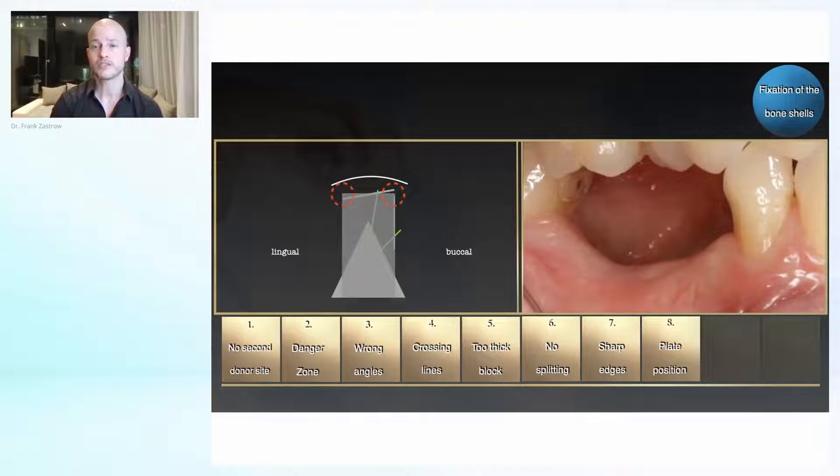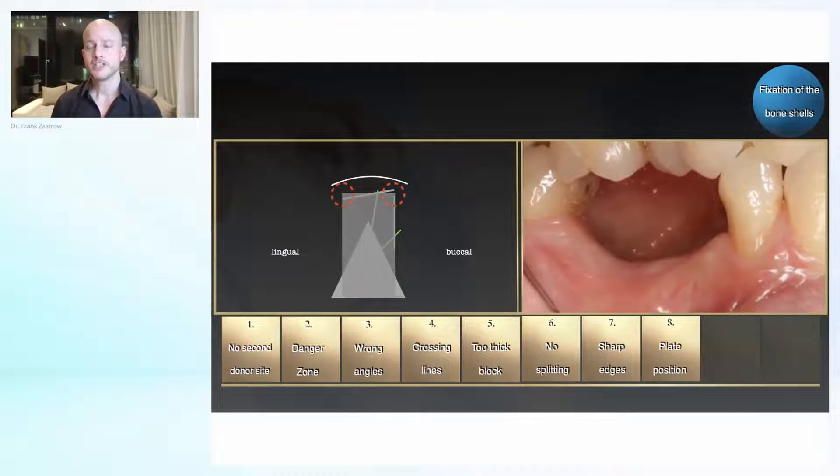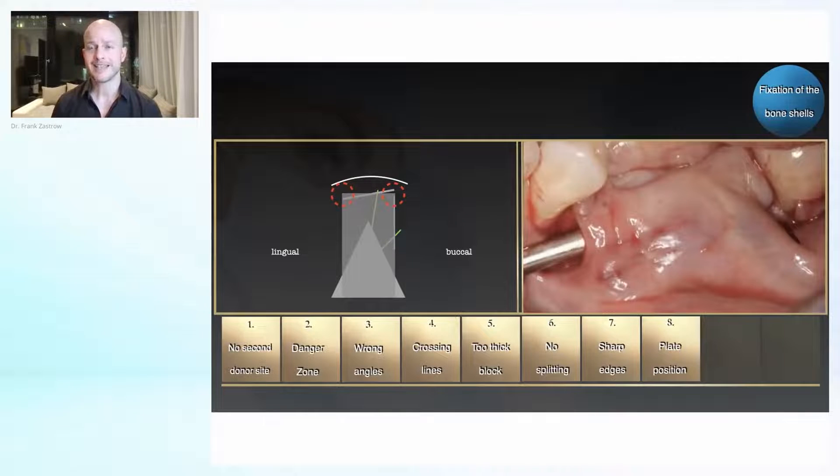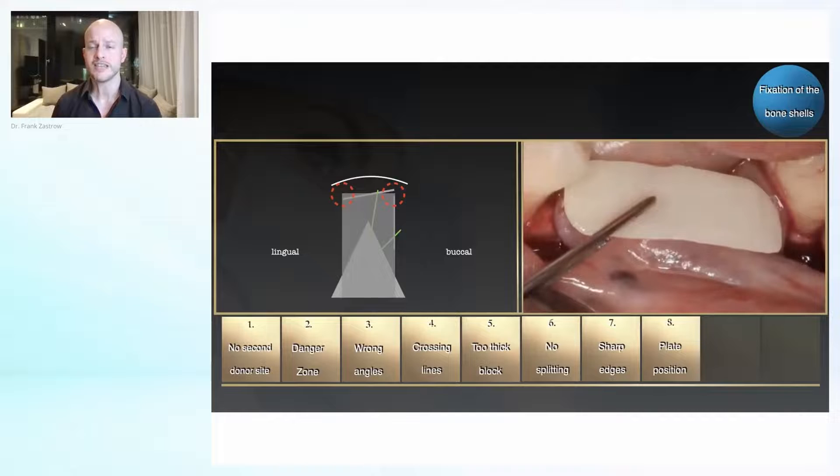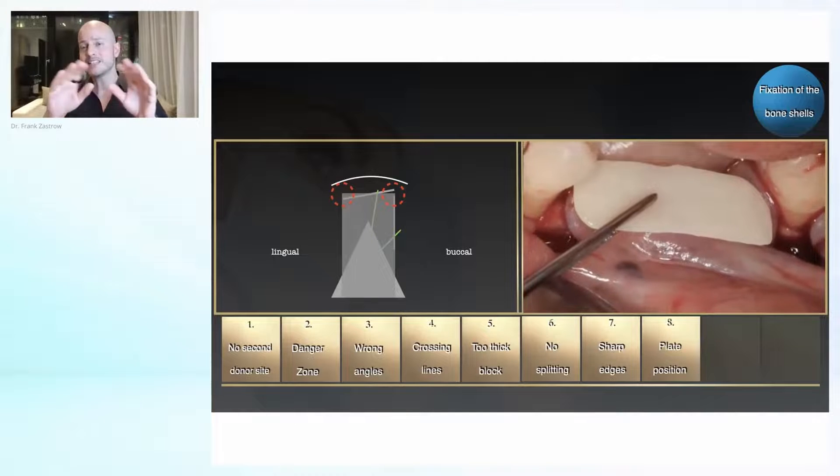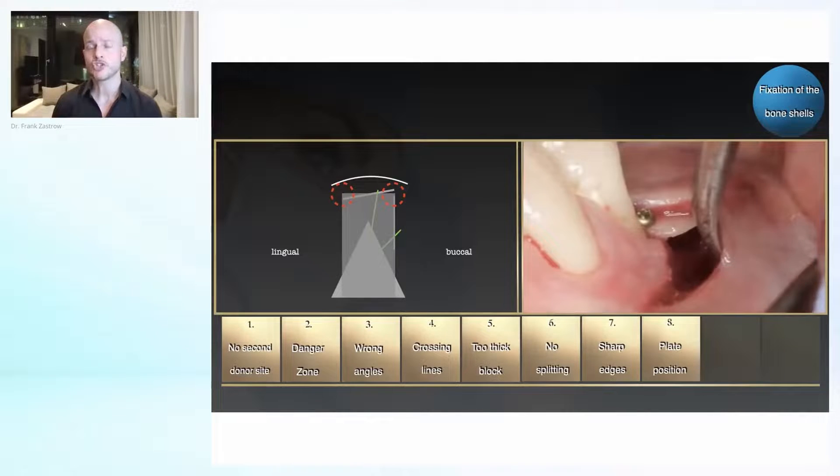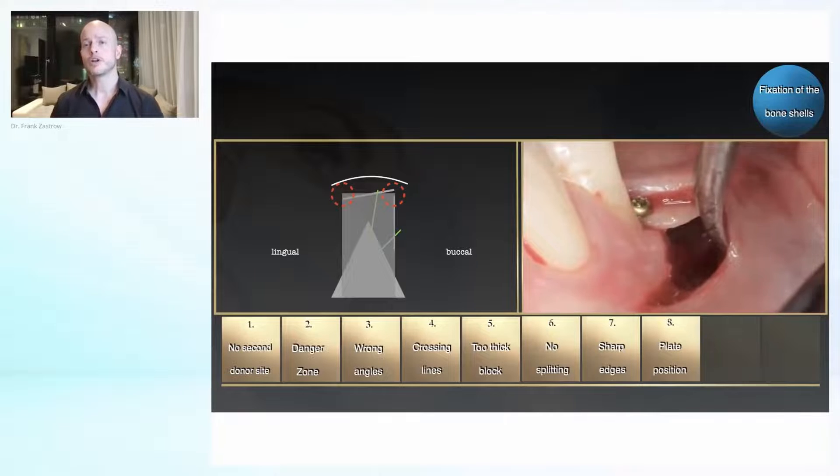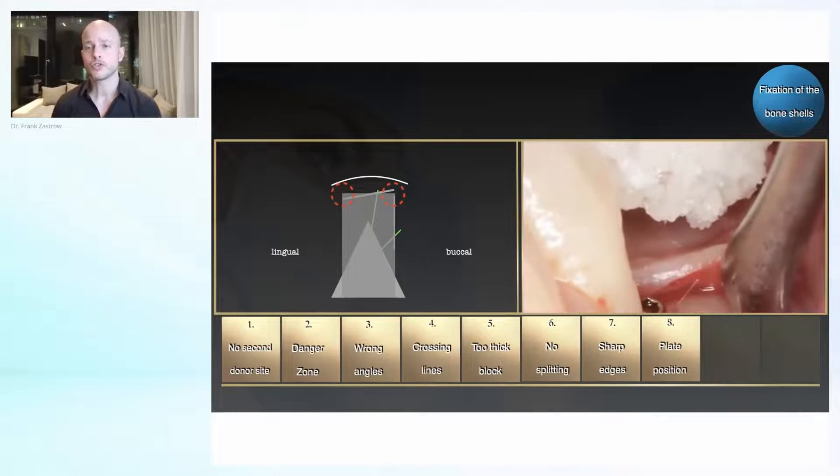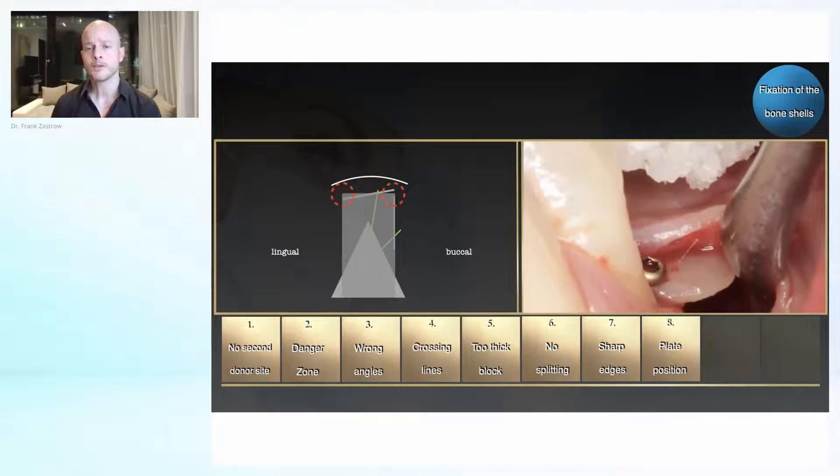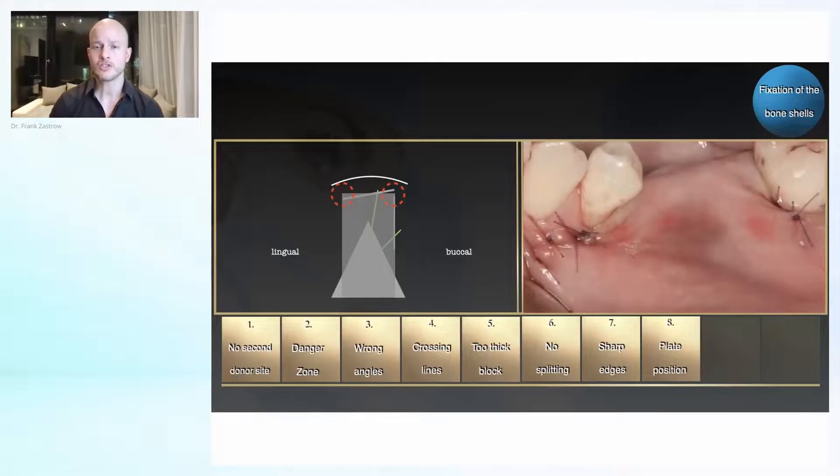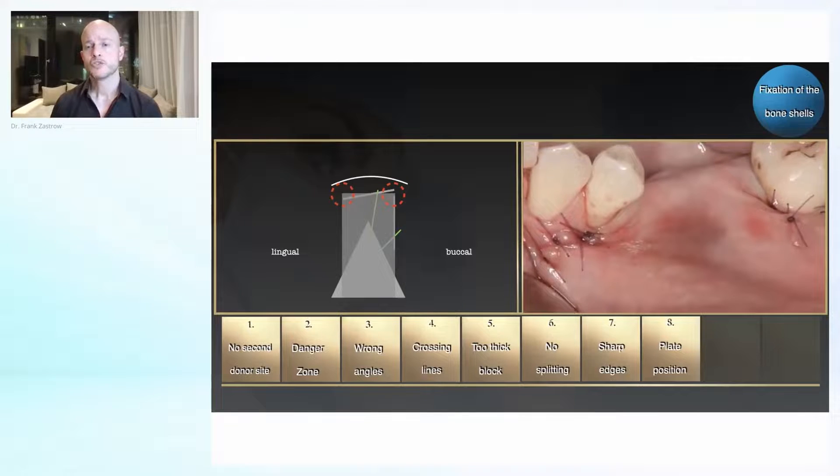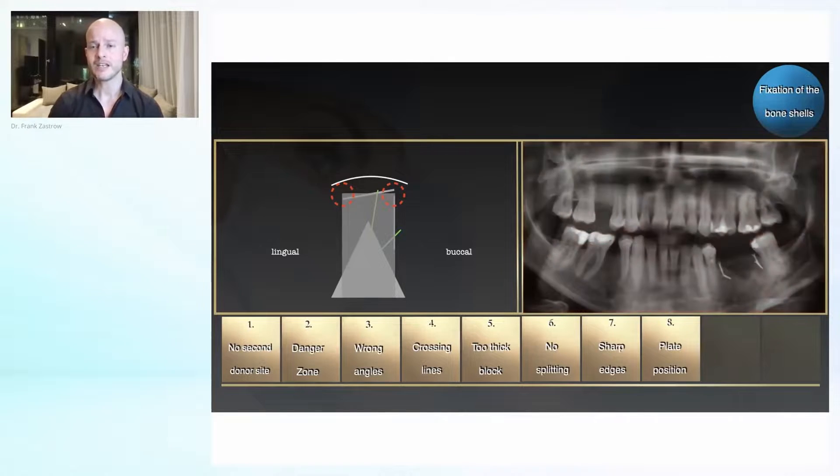You see here one case using a right angle technique with a tunnel technique. The plate is nicely rounded—all sharp edges are rounded off. This is one of our eight techniques we teach in our courses, and we fix them with the TMS screw system. You see here the result in the end.